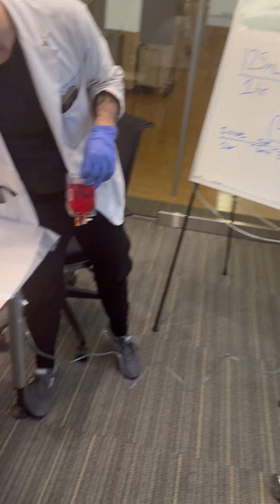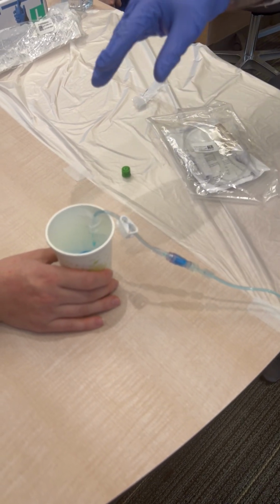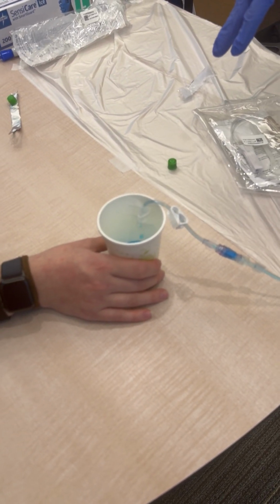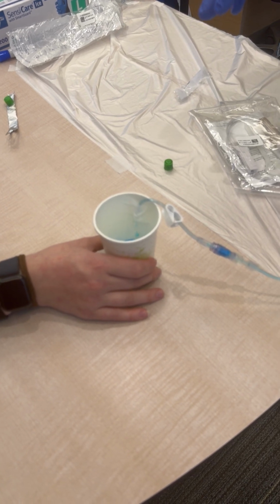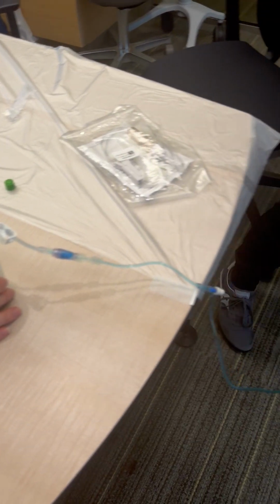I come back and check my patient. How's that feeling for you, Gabby? Fine. Good. How's the IV feeling? It's not stinging or anything like that? No. Is it a little cold for you? A little cold. A little cold? Okay. I'll get you a warm blanket after I get out of here.